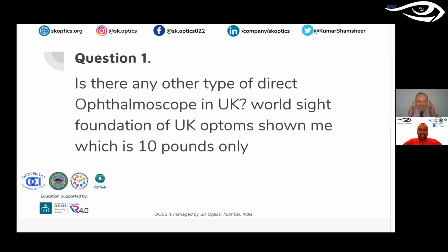And I think those probably are for field work, for doing eye screening camps, which might have one magnification and a bright source of light to just look at the functionality, whether the retina is good or not. Maybe that's the one. It must be quite a simple device, and the functionality must be quite low.